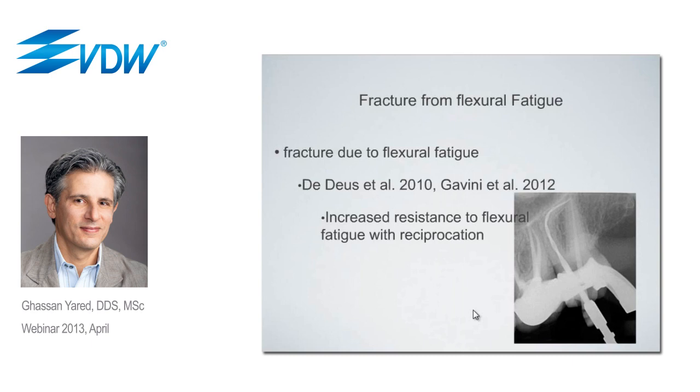There are many studies, these are only two, that have shown that the use of reciprocation increases the resistance to flexural fatigue. So flexural fatigue isn't a serious issue in single file reciprocation because of that, but also because with this concept, it is recommended to discard the instruments after each case. So if there is any flexural fatigue, it won't be a problem because that instrument will not be used for a second case.